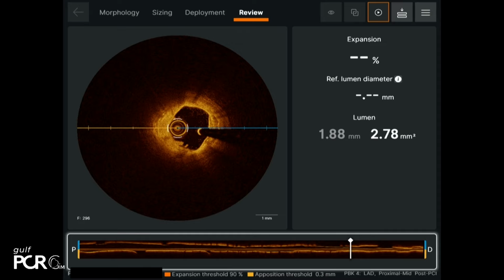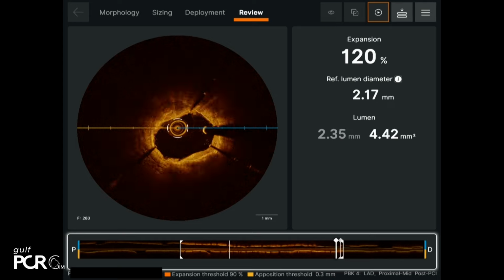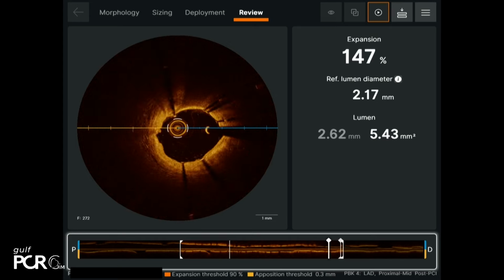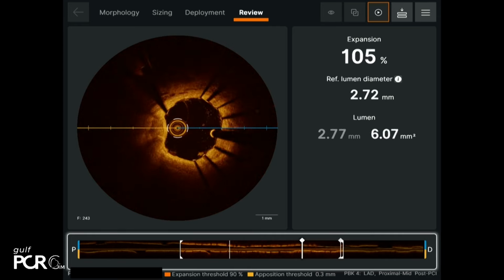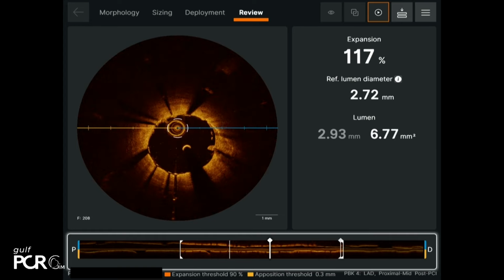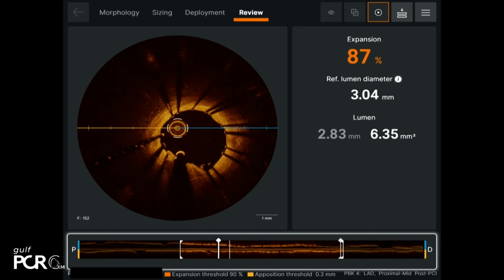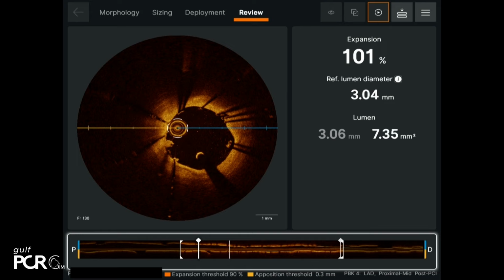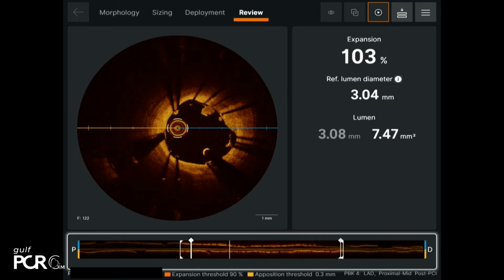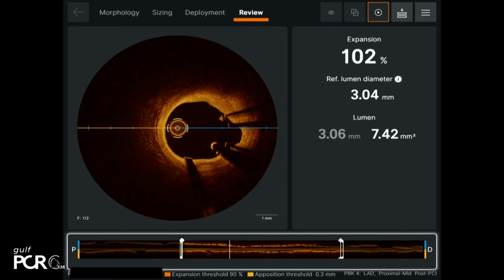Okay, Ibrahim, we're doing the run from distal toward the stent. I think we have a better result here. Stent expansion is much better here, and to me, there are fewer clots. Now the stent expansion is good, and we're not seeing anything yet below 80. And we're coming to the proximal part. There was some mild malapposition and some clots. And the malapposition so far is not bad.